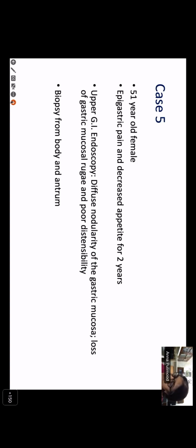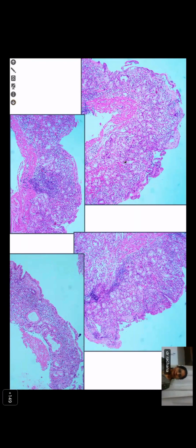So who has not described? Is it Rachana? Yes, ma'am. Okay, so Rachana, what do you think? Ma'am, this is studied from stomach mucosa. In this, we can see mucosa, lamina propria, and some layer of submucosa. In this slide, we can appreciate inflammatory cell infiltrates in lamina propria, like plasma cells and eosinophils. The mucosa is edematous. We can see edema.